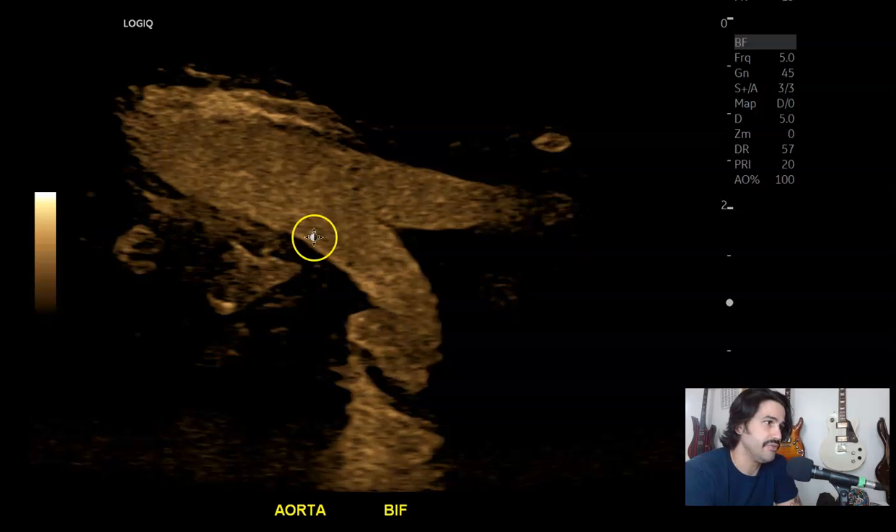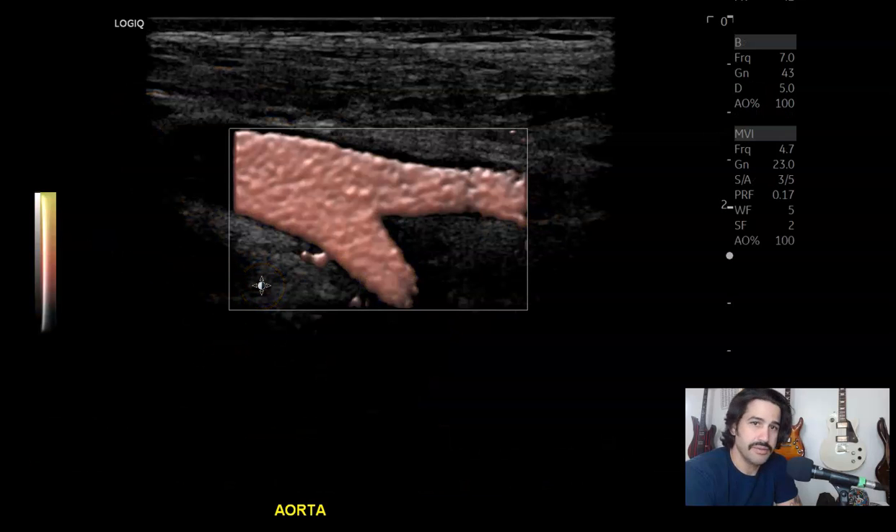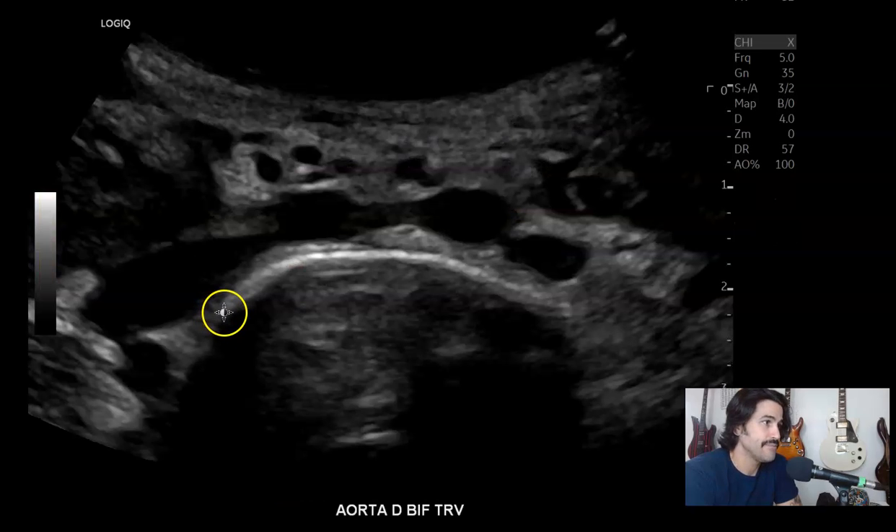And this is just regular B-flow bifurcation. Then MVI — microvascular imaging — with the linear probe. If there was any type of stenotic activity there, you'd definitely see it. Then transverse: right common iliac artery, left common iliac artery.